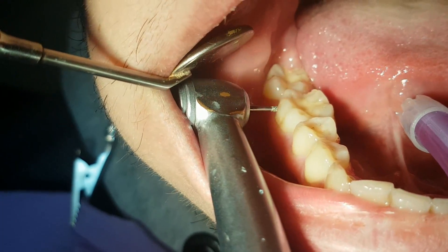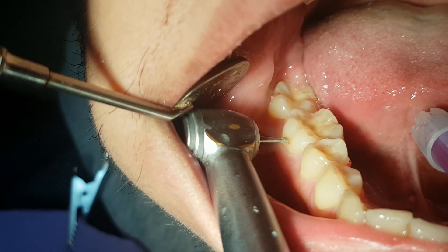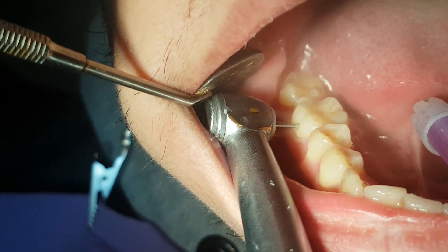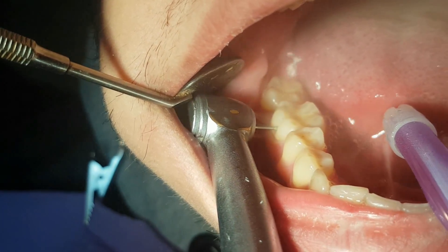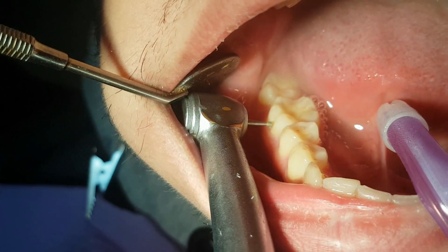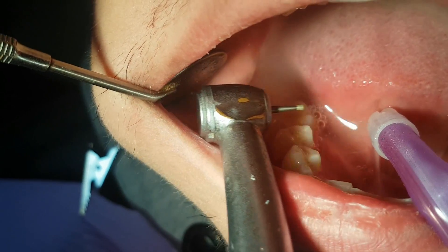We use a dental turbine — an instrument with high rotation — to open up the enamel, so we can clear all of the cariously changed tooth structure.